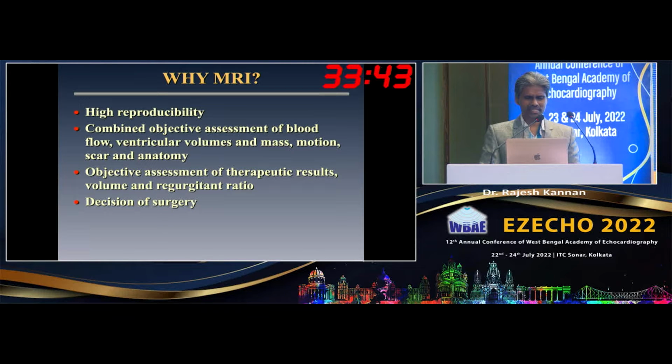Also, we can use this as an objective assessment in different therapeutic trials where you need accurate quantification and reproducibility, as well as for decision making, whether a patient needs surgery or not, where there is a mismatch between the echo and the clinical findings.